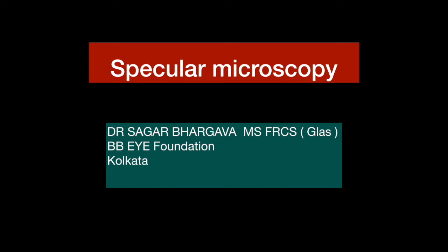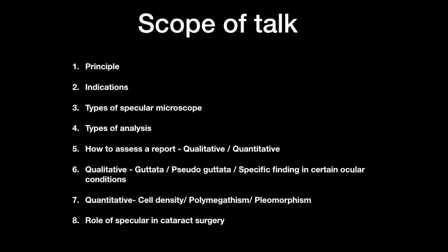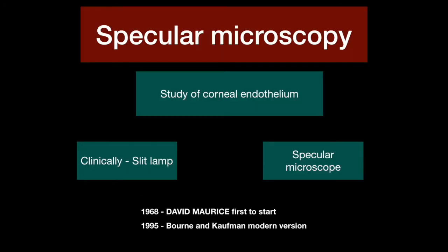So my next talk is on specular microscopy. These are the points that I would like to cover. Now, as we all know, specular microscopy is a non-invasive photographic technique that allows you to visualize and analyze the corneal endothelial cells.